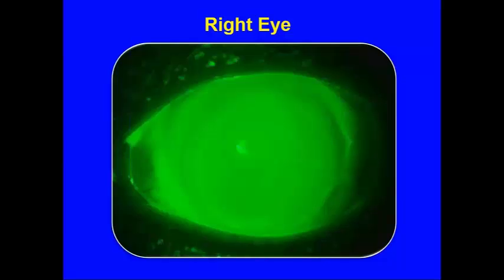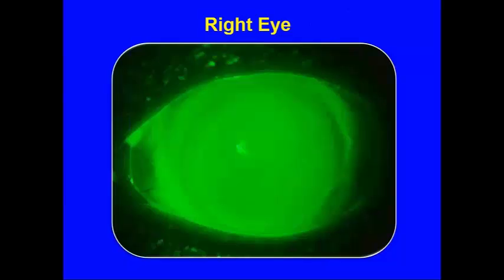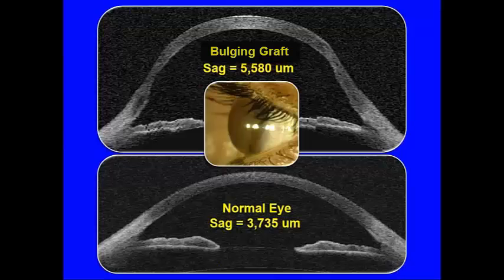We now have increased the depth of the lens centrally, 125 microns, which has alleviated the thinning down here, and we've eliminated that area of fluorescein thinning up on top. We can see here that by simply placing one diagnostic lens on this patient's eye with 18 diopters of corneal toricity, we're able to communicate to the laboratory the necessary changes to make to create this perfect fitting lens. Now, this patient has been wearing this particular lens for well over a year now and is enjoying 20/25 corrected acuity with his scleral lens.